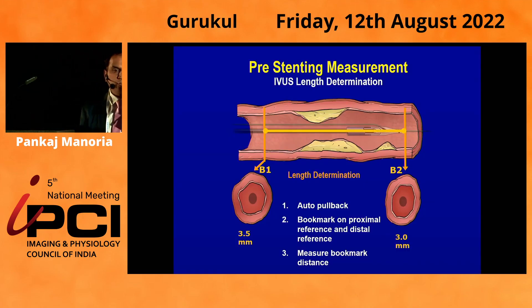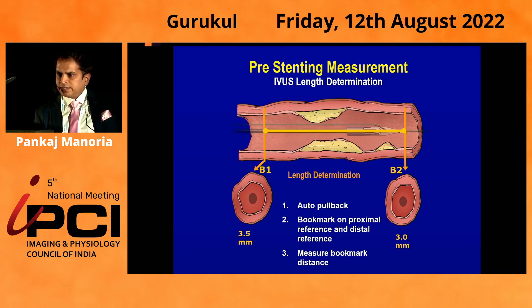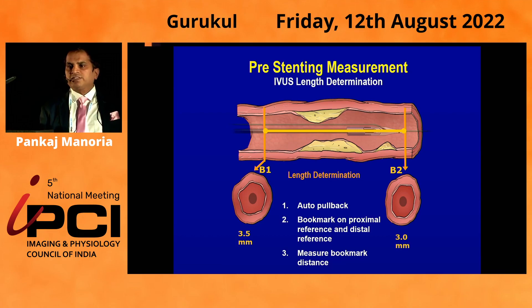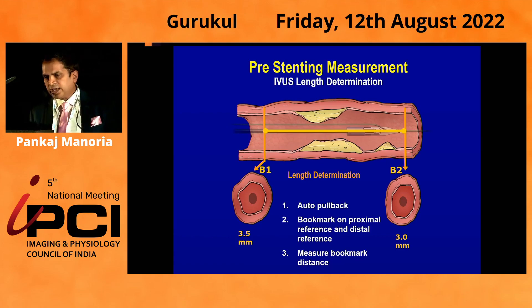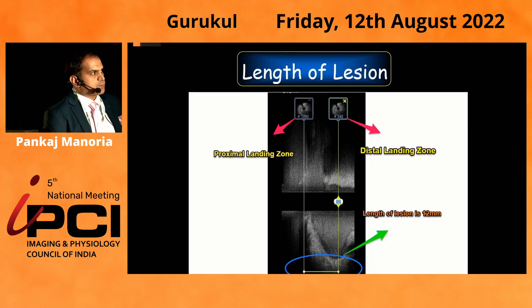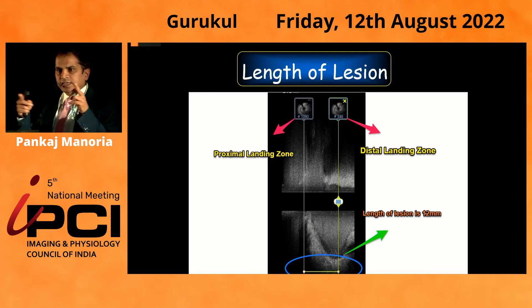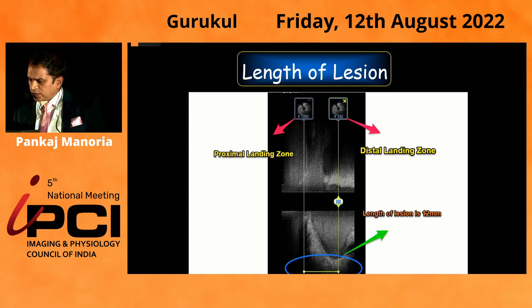How do you measure the length of the lesion? It's very simple. Mark the distal reference segment — the nearest normal segment distally — bookmark that, then mark the proximal reference segment — the nearest normal segment proximally — and measure the distance between the two bookmarks. It gives you the exact length of the lesion and the exact stent length needed. For example, in this case, the distal and proximal landing zones are bookmarked and the software automatically measures the length between the two bookmarks.